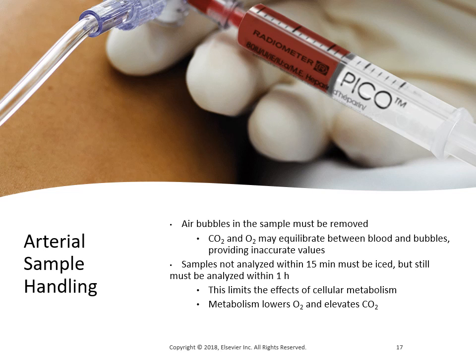If the analysis results fall outside the analyzer's reportable ranges, results are flagged. The remaining sample should be sent to central laboratory for analysis. Of course, the RT should never wait for repeat results if the findings indicate a life-threatening problem. For example, if the bedside results indicate oxygen levels below the analyzer's reportable ranges and the patient is cyanotic, the RT should immediately start oxygen administration or raise the FiO2 while awaiting test results from the central lab.